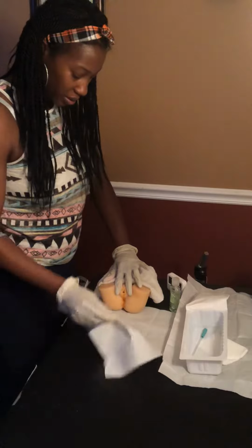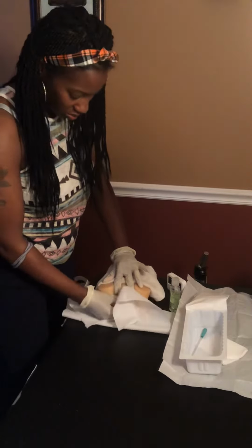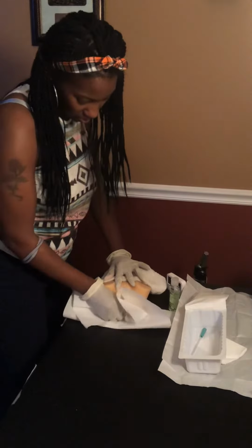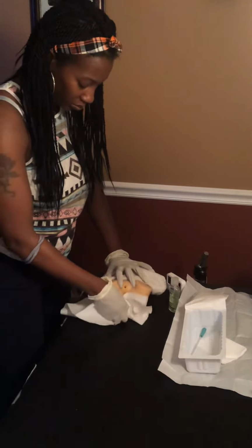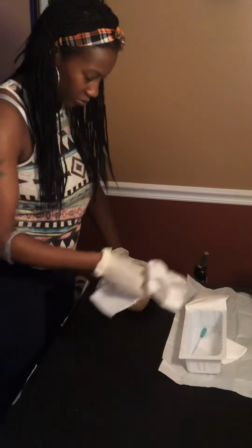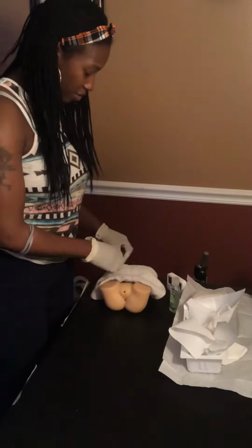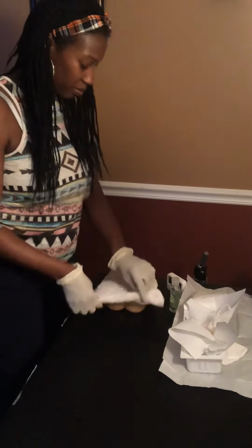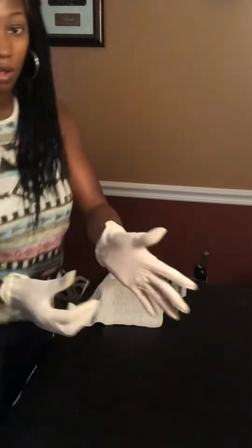Wipe the patient. One wipe down the middle. Cover the patient for privacy. Get rid of the stuff. Take your gloves off.